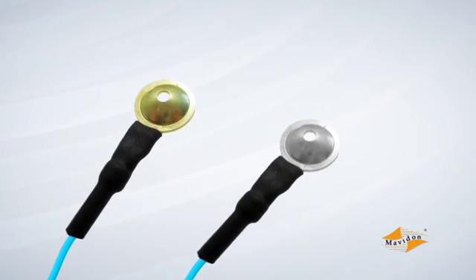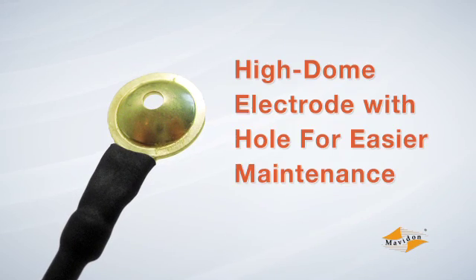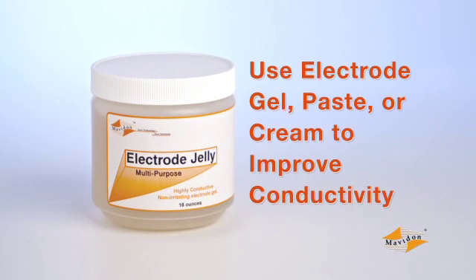Electrodes are available in gold and silver with different style cups for different applications. Long-term EEG monitoring in a lab or hospital setting typically uses high-dome electrodes with a hole in the top for easier maintenance during the study. Ambulatory recordings and sleep studies may opt for electrodes without the hole in the dome. All electrodes require electrode gel, paste, or cream to improve conductivity.